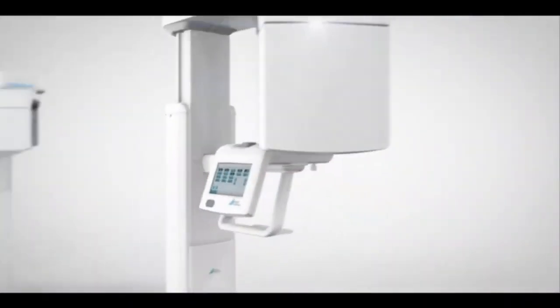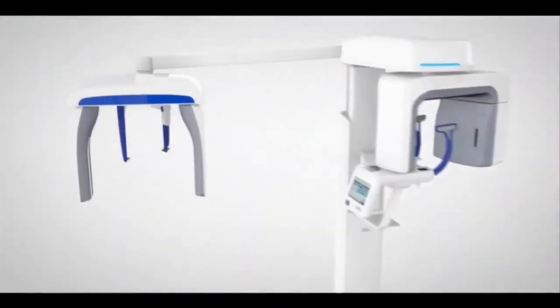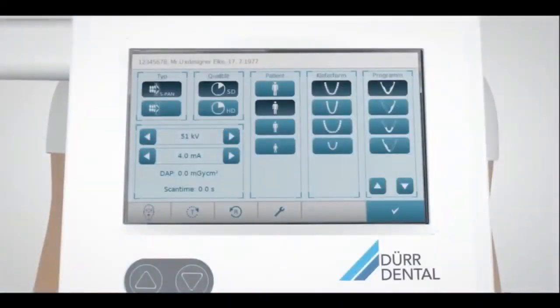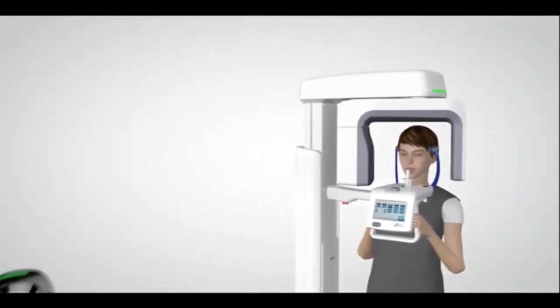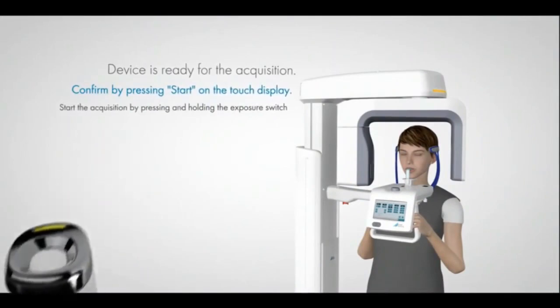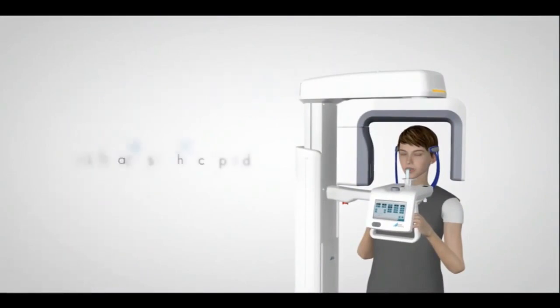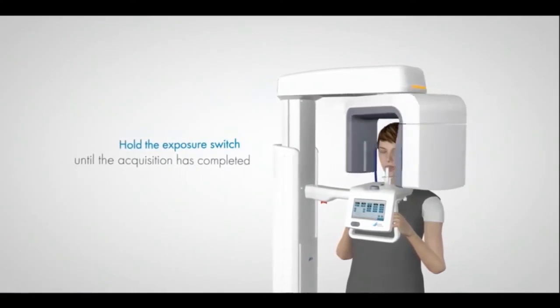A panoramic radiograph is a panoramic scanning dental x-ray of the upper and lower jaw. It shows a two-dimensional view of a half circle from ear to ear. Panoramic radiography is a form of focal plane tomography. Thus, images of multiple planes are taken to make up the composite panoramic image, where the maxilla and mandible are in the focal trough and the structures that are superficial and deep to the trough are blurred.